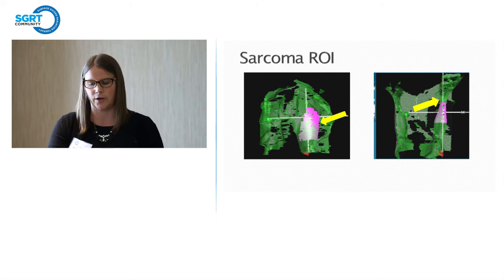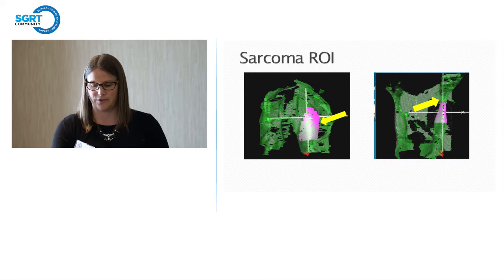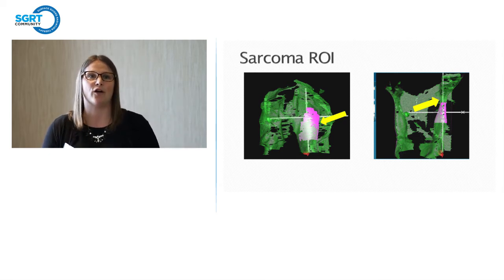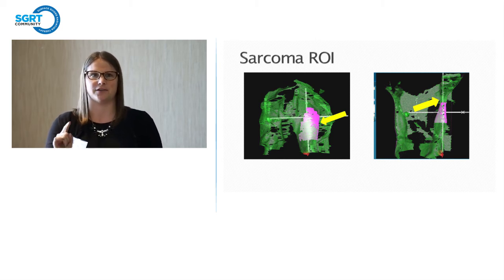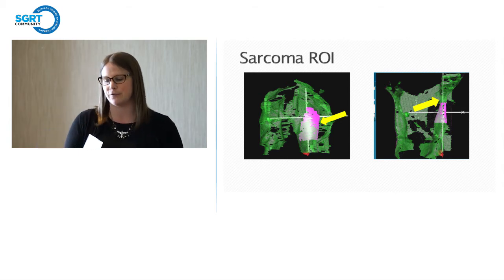So I have an example here. The one on the left isn't really a great one because of that. All that skin looks the same. Also, there's a part of the sheet at the bottom there. That's a big mistake on the first day. The patient's cold, you'll want to cover them up, and then we leave and go to take the reference image, and you're trying to set your region of interest around half a sheet that's covered up. If it reads that, it's going to read that as part of the surface of the patient and throw off any adjustments that you have.